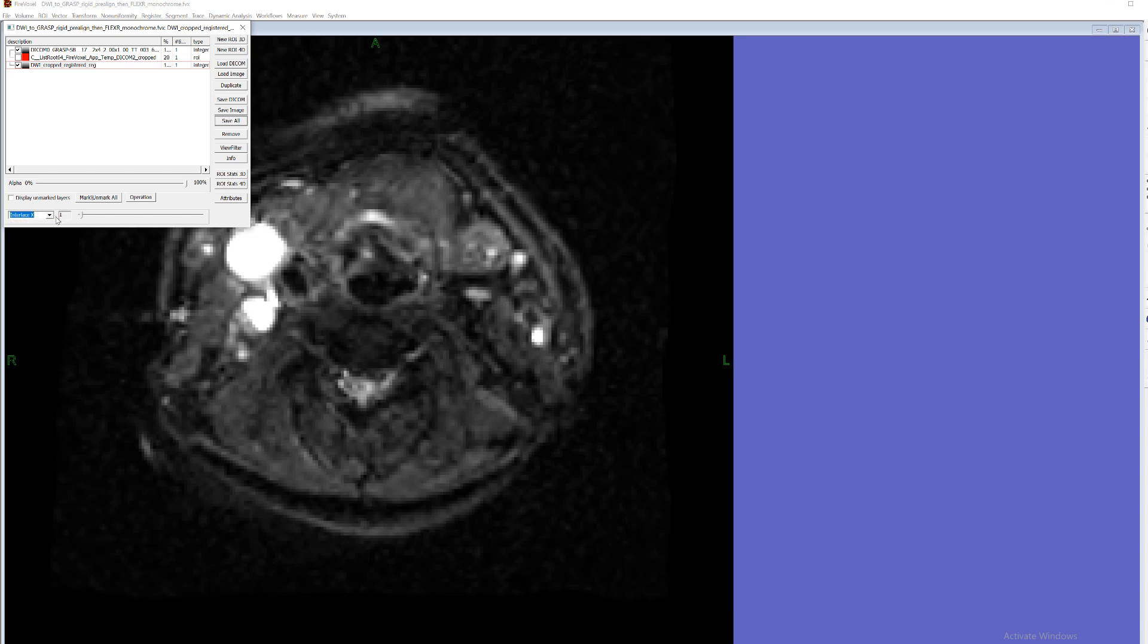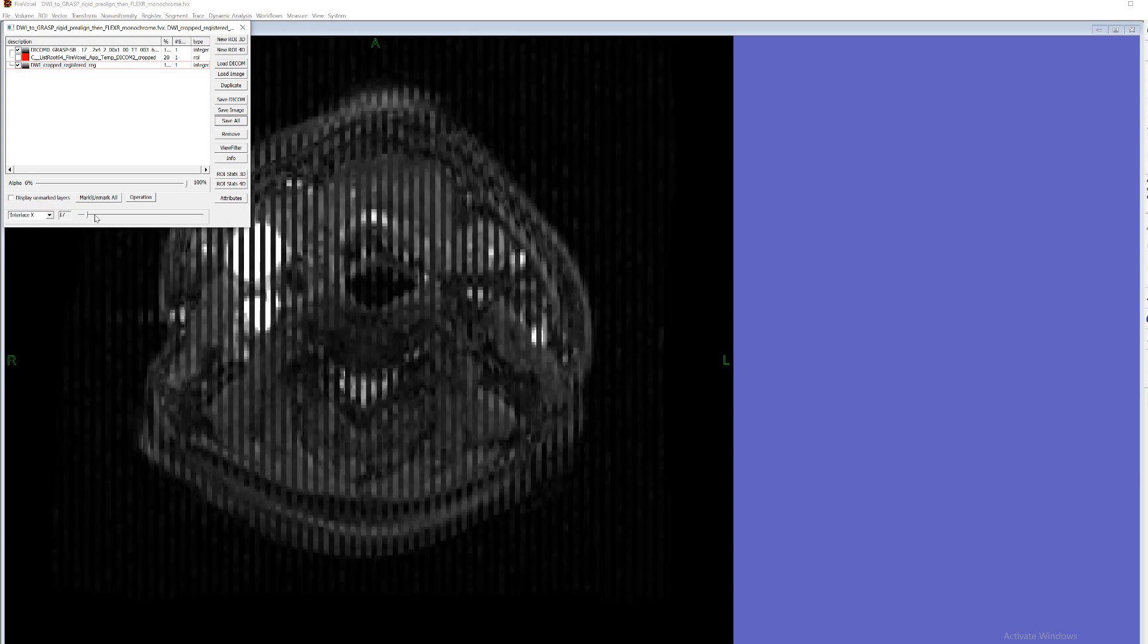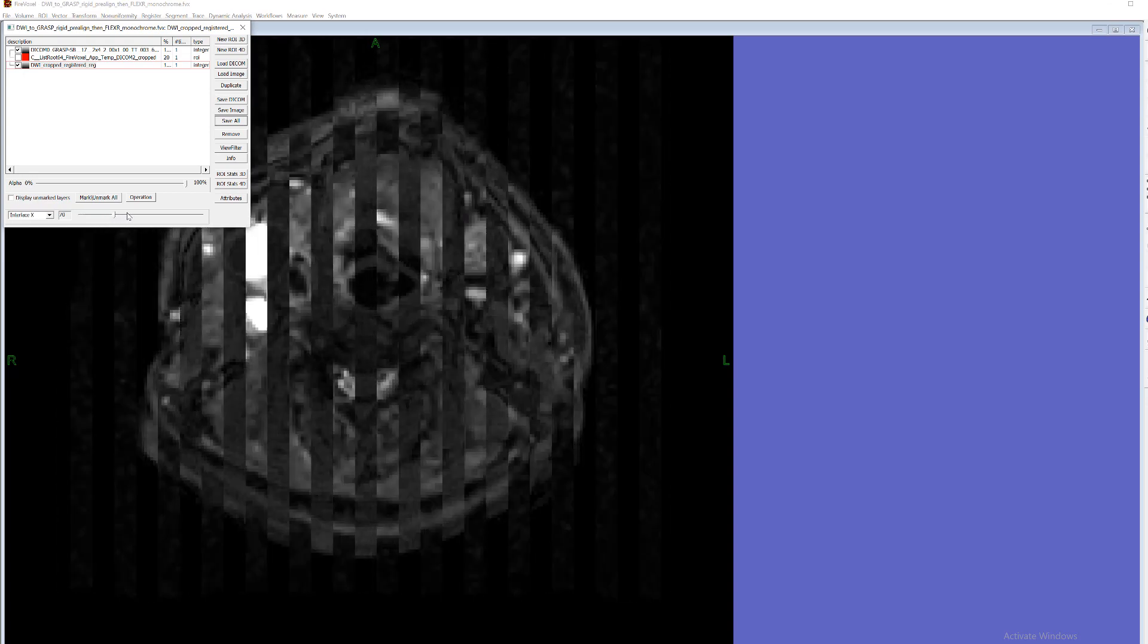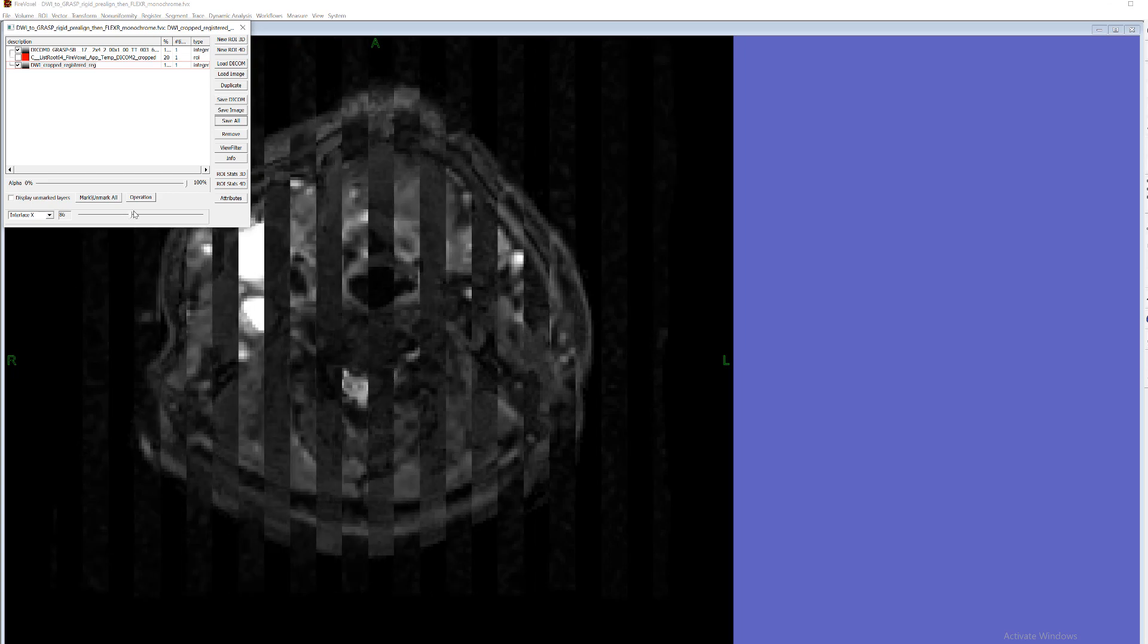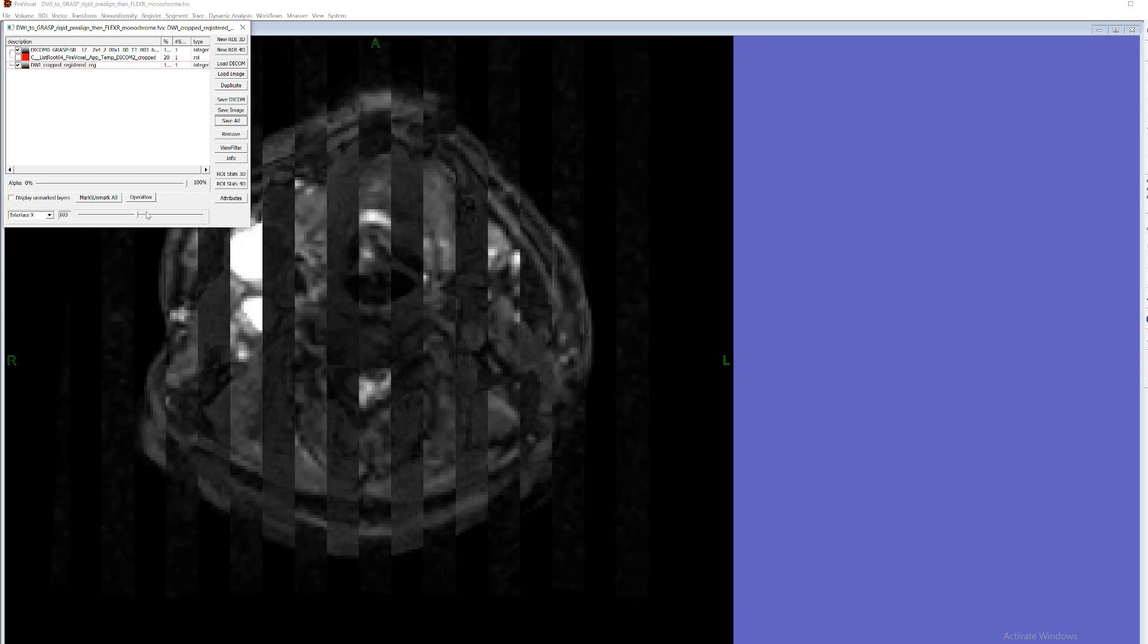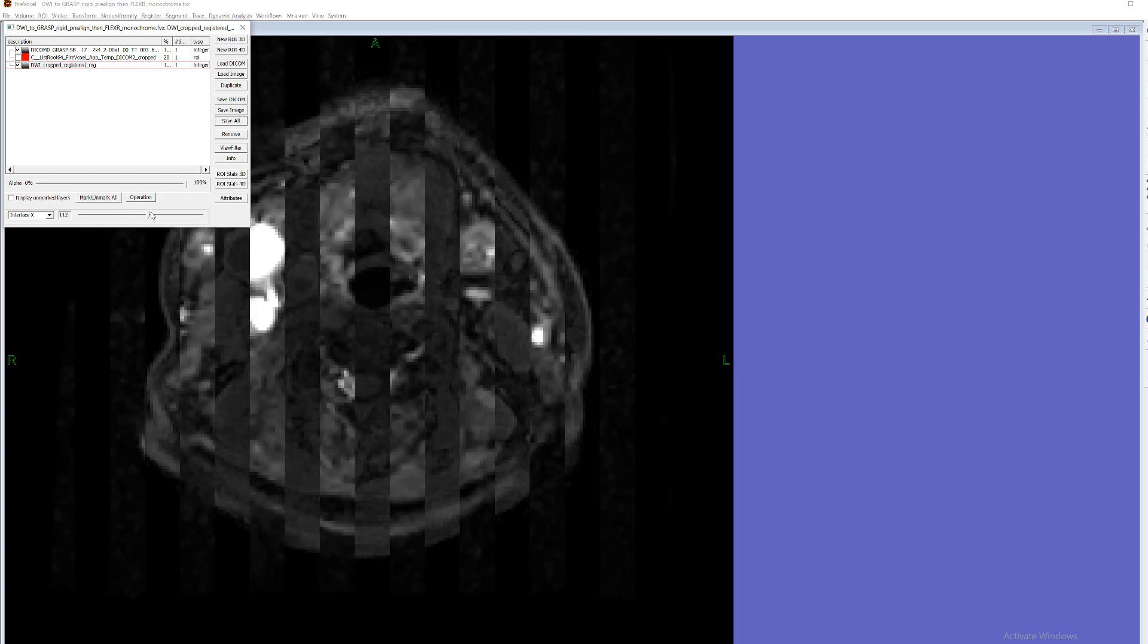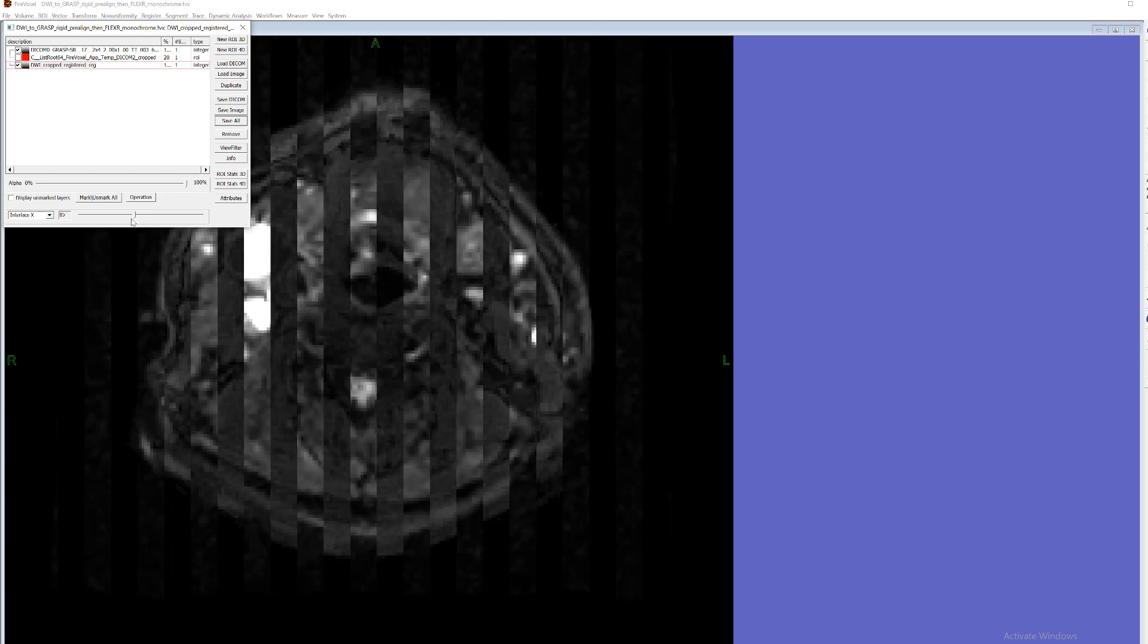And then we have X. And then there is this interlacing stride. When it's 0,1 it's basically no interlacing. But then as we change the interlacing making it larger, the stripes of interlacing are displayed in the order of the layers. So this is X interlacing and it goes up to 200.